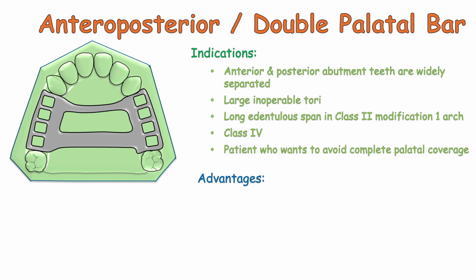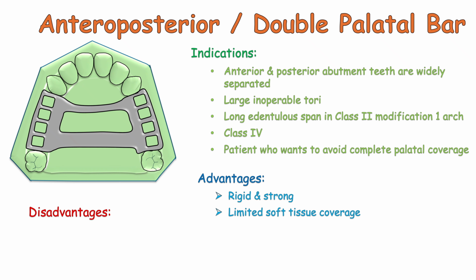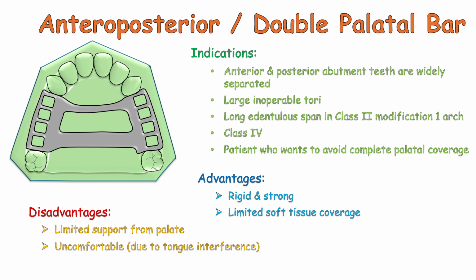Advantages: it is rigid and strong. It has limited soft tissue coverage, so complications like papillary hyperplasia are limited. Disadvantages: it has limited support from the palate, and it is uncomfortable due to tongue interference.